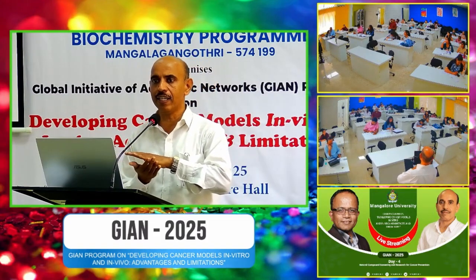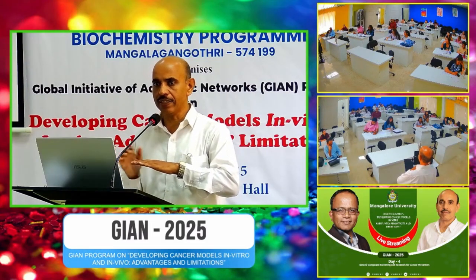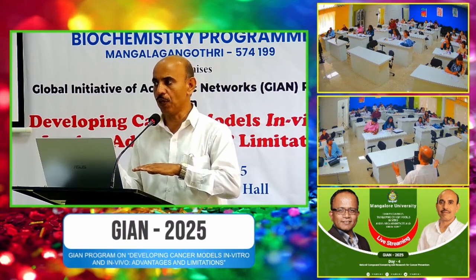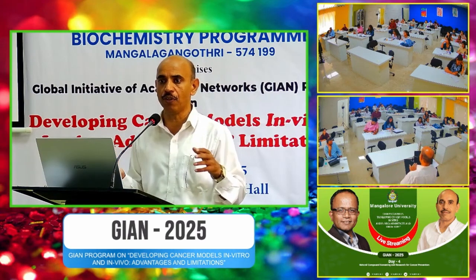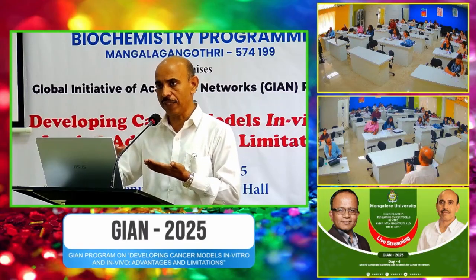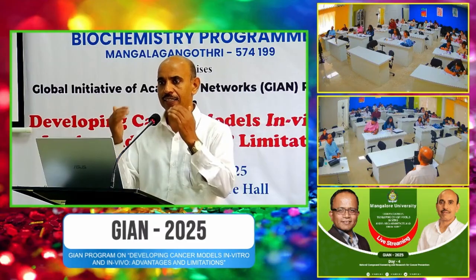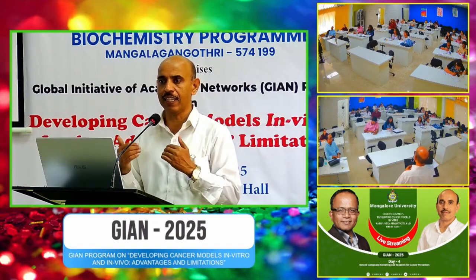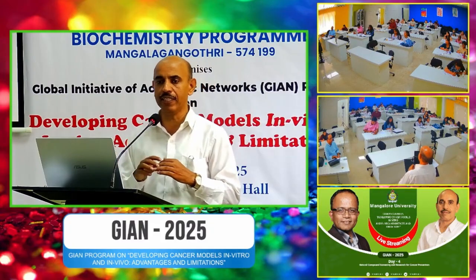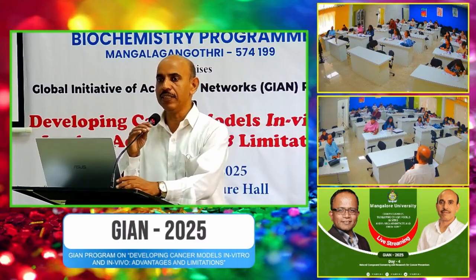Make sure the whole area is covered with the trypsin, even if you are adding around maybe 0.25 ml, depending on the culture flask size. You wait till the cells start getting detached, and then you add the media, because the advantage is that if the media contains serum, this FBS itself can act as a stopping agent for the trypsin.